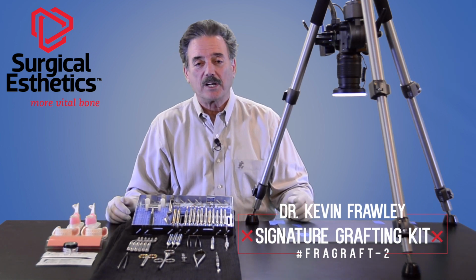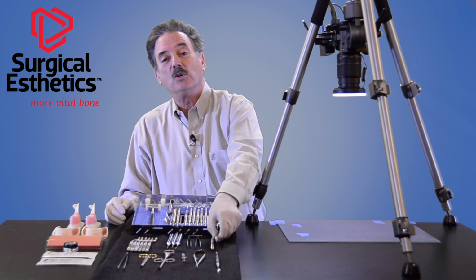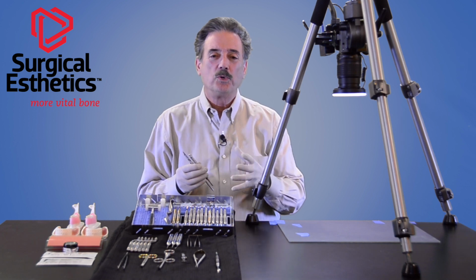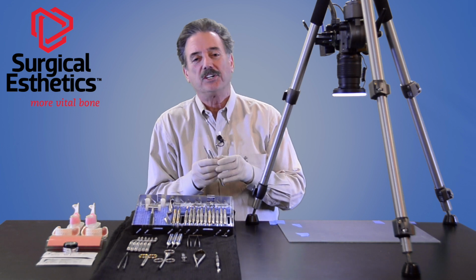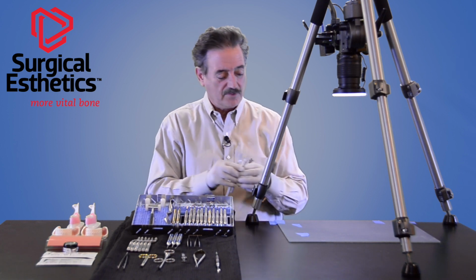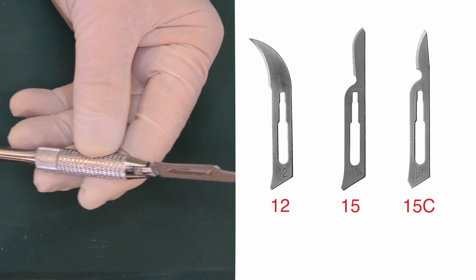So the first instruments we're going to talk about are the blade holders. We're all pretty used to the old blade holder we used in school, which was a flat blade holder. Well, using a flat blade holder, you really can't make delicate cuts. You can't make a nice clean turn in the sulcus. So really important that we go to a round blade holder. The one we prefer is this particular blade holder.